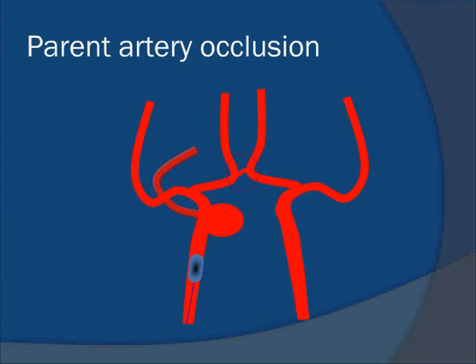So you have a look at the anterior communicating artery, have a look at the posterior communicating artery. Sometimes you find that when you inject from the opposite side, just the opposite ACA fills up, but the MCA doesn't. And you make an injection in the vertebral, you find the MCA is filling from the posterior communicating. So it's important you make a study in both vertebral and anterior communicating arteries before you finally decide to do the procedure.